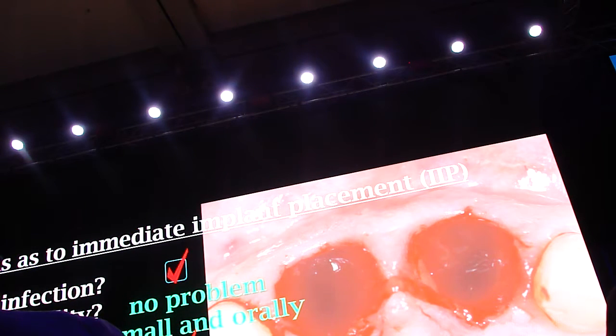Should we fill the gap? I think yes, we should fill the gap. And can we maintain the buccal tissue? Hopefully yes, and as you know, hope dies last.